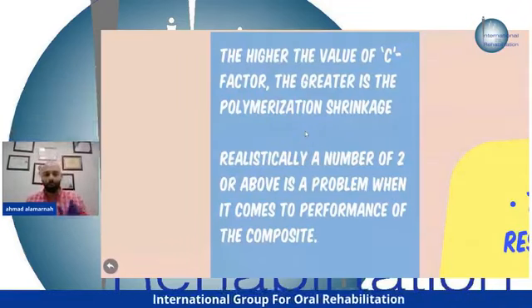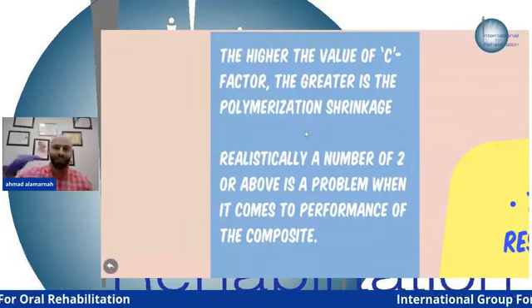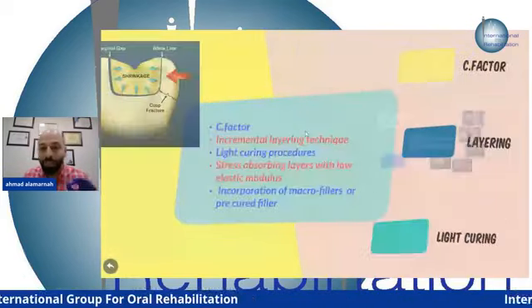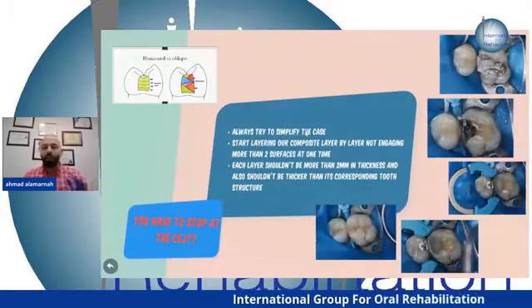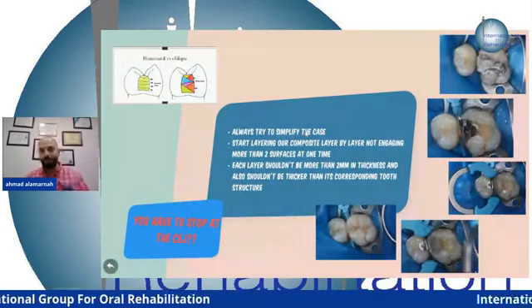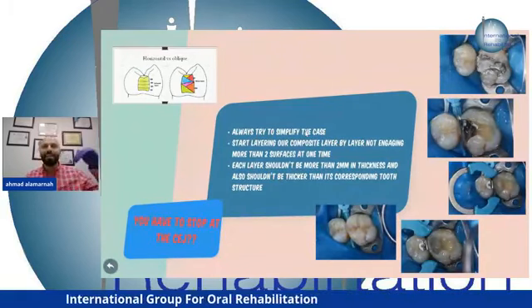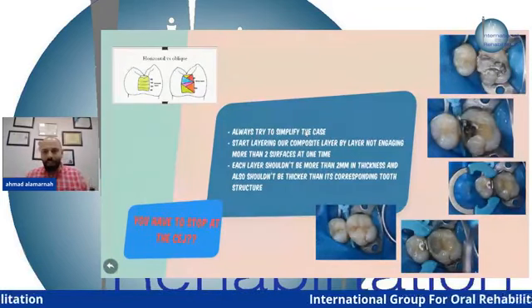So for the C-factor, any value above 2, you have to consider it as a danger zone. So how to manage it? By doing a layering technique. What do we mean by layering technique? To engage at most 2 surfaces at once, okay? 2 surfaces at one time, with the thickness of each layer less than 2 millimeters for the light to pass through it. This is an example.